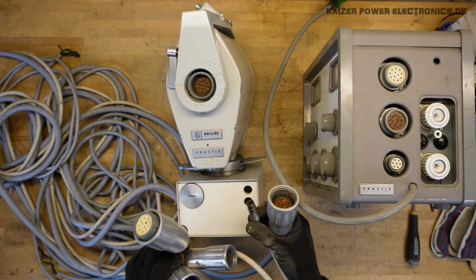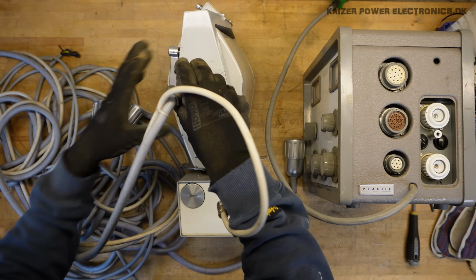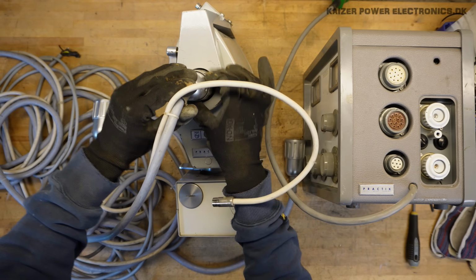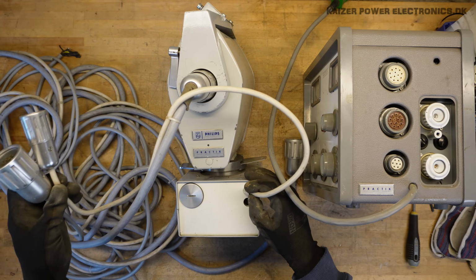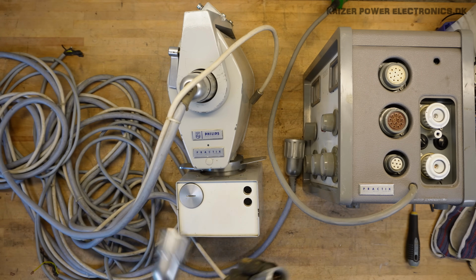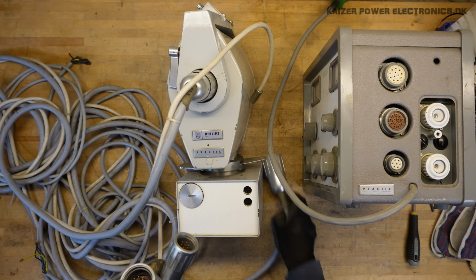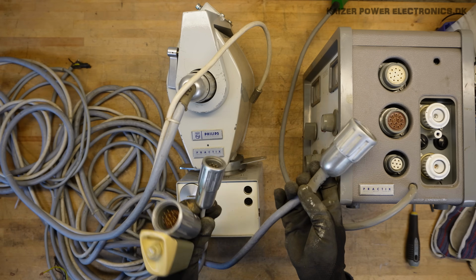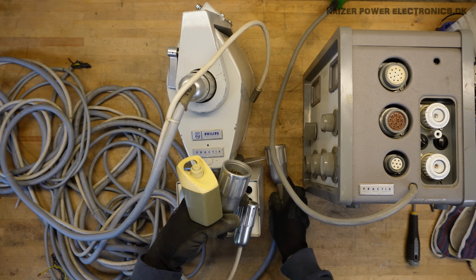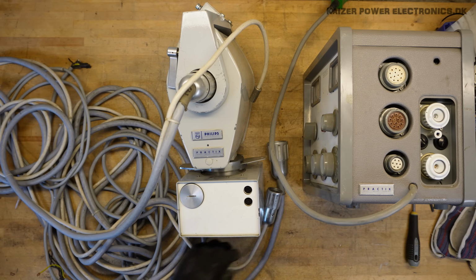So the one here, that should be what connects to the head. Hopefully that fits. Yeah, that fits there. That goes to the collimator. That's probably for the light. And then over here we have the power connector that goes to here, and then we have the double actuated activation switch here, and then we have the small one.